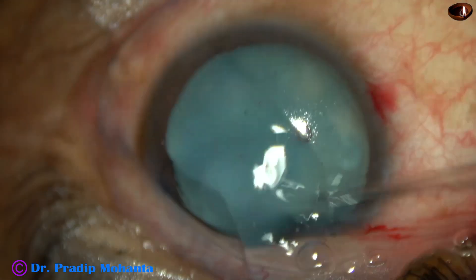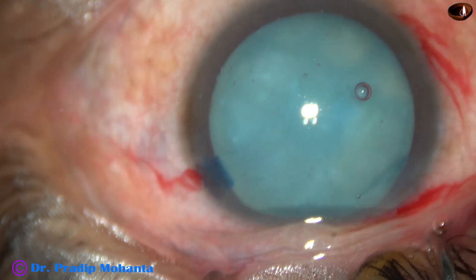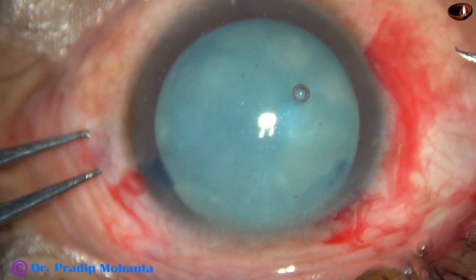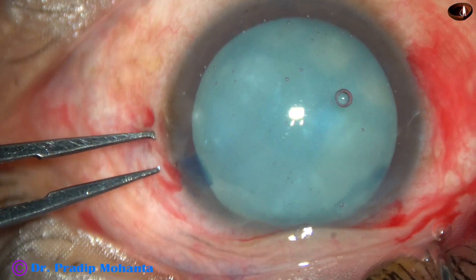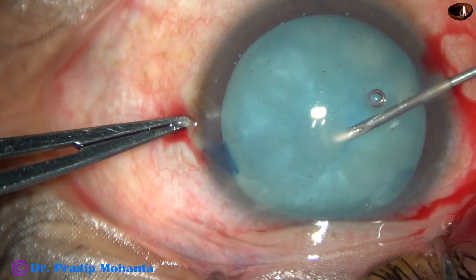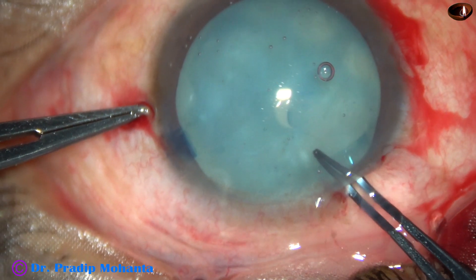And now a 26-gauge bent needle is taken and goes into the right side port. The eyeball is fixed with the fixation forceps. The eyeball should be nicely fixed. The needle goes in, then the anterior capsule is punctured.